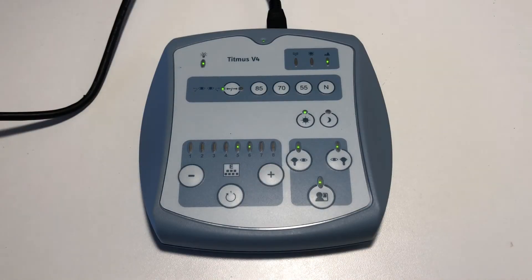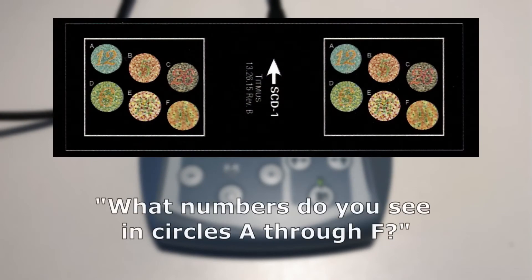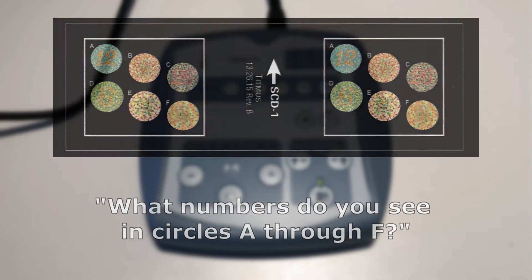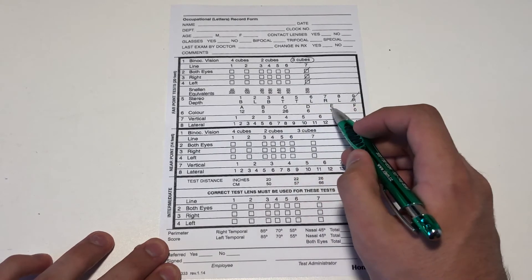Advance to slide number six. This slide tests for red-green color perception. Ask the patient, what numbers do you see in circles A through F? Record the results by putting a slash through each incorrect answer.